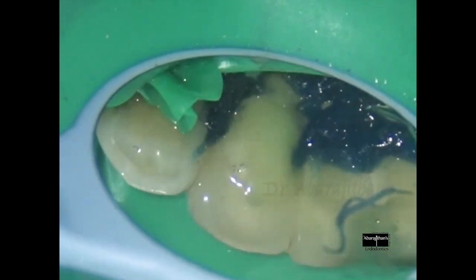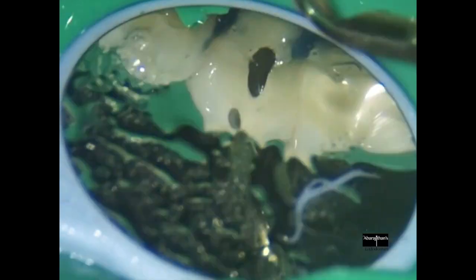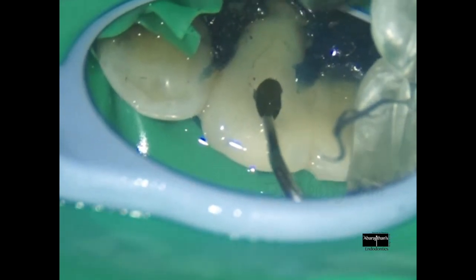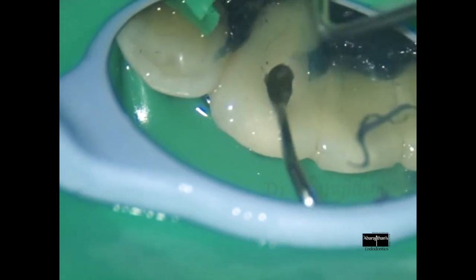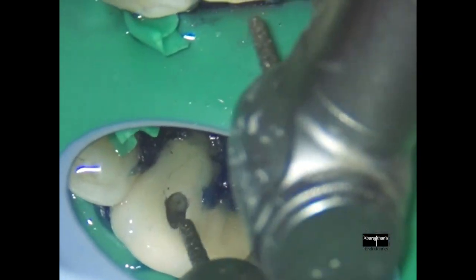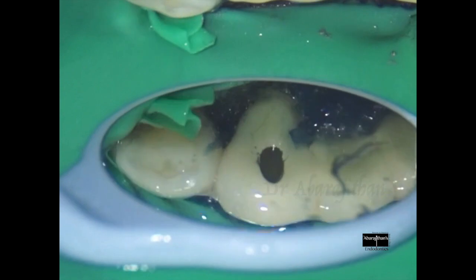I am just clearing the debris, which I often prefer to do with a scaler with water. Then checking for straight-line access with my DG-16. You could see that I need to do some more de-roofing, which I will proceed to do with my traditional diamond burr. The metal cutting burr was just used to drill through the metal, and once I am done with that I change back to the normal burr to establish proper straight-line access. I will not be too conservative when doing an endo through the crown.